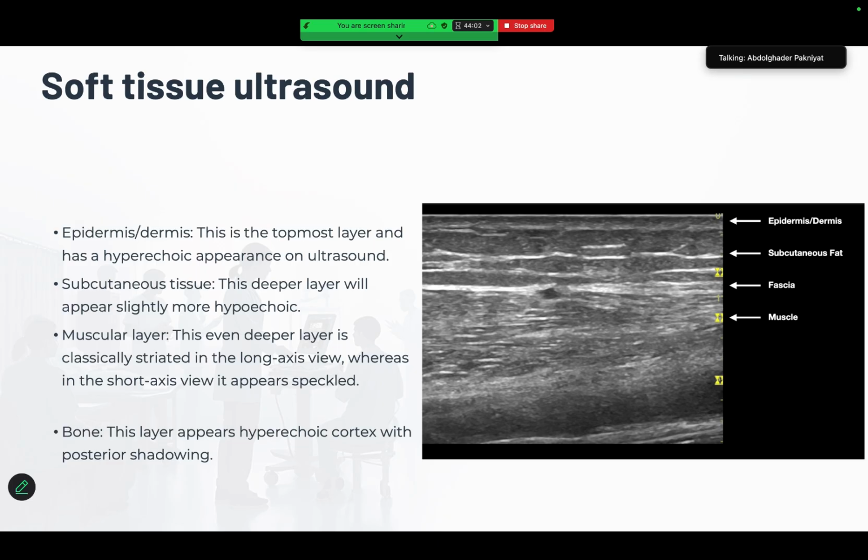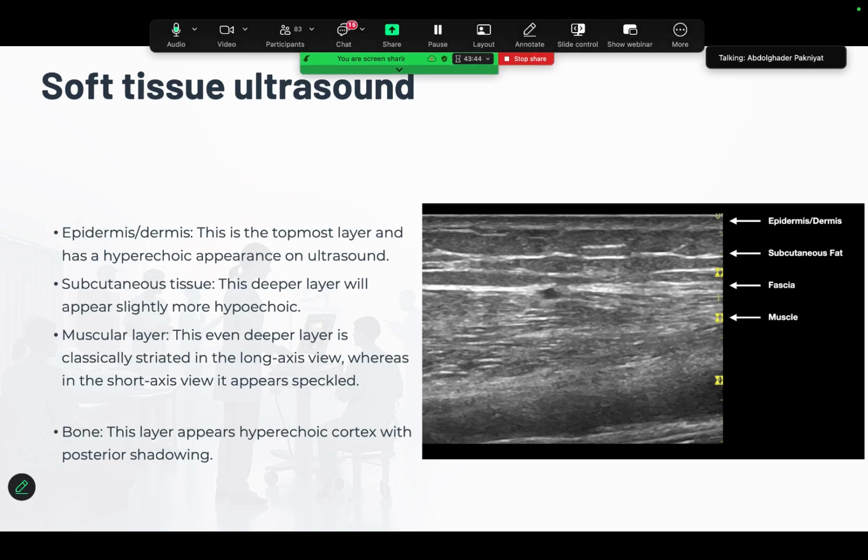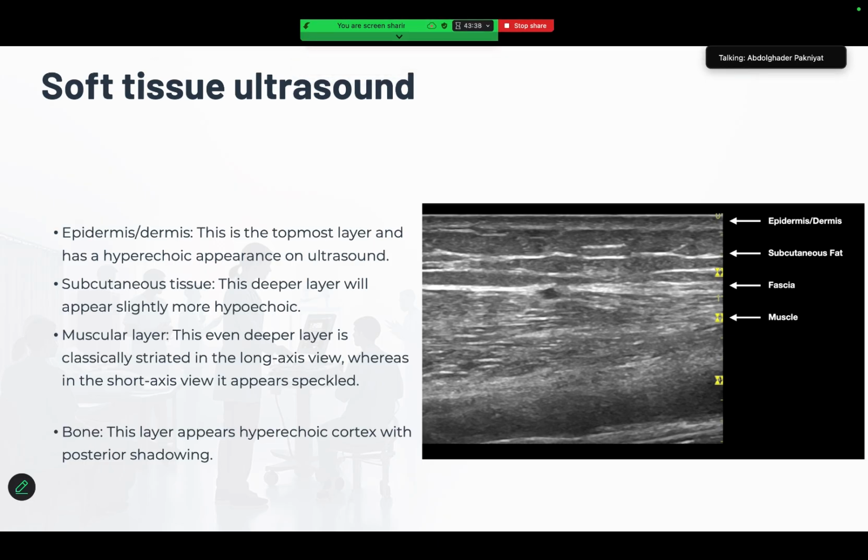So we discussed the importance of the POCUS, how important it is to use the POCUS. If you don't use the POCUS, we may miss atypical cases or early stages of some important infections. And then we will discuss how to set our device, our machine, which probe we should use, and what is the best probe. It depends on the anatomical location of the body and different body habitus. And we talked about the depth, the focus, and the gain. We need to adjust all of them to have better images.